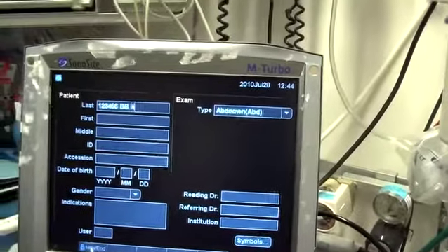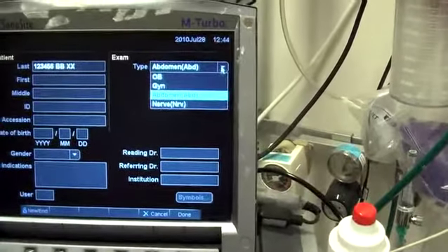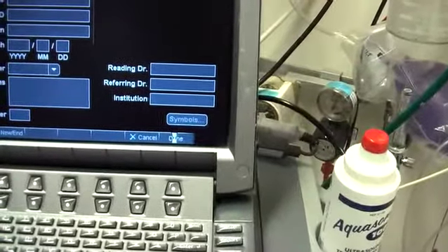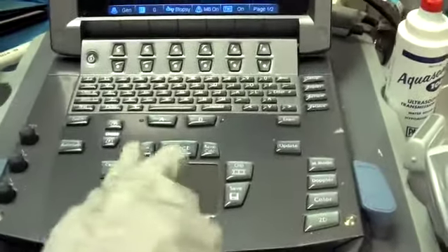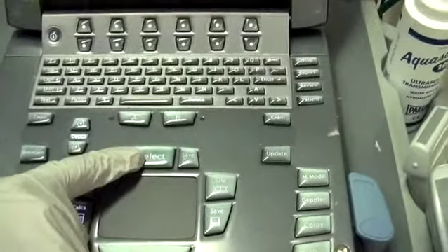Over here under exam, you can select the type of exam depending on which probe you have selected. So we'll just stick with abdomen, and then you hit the done button. How are you selecting things? What are you using as a mouse click to select? There is a track pad here, and the select button is what you push to click. It's the equivalent of a mouse button.